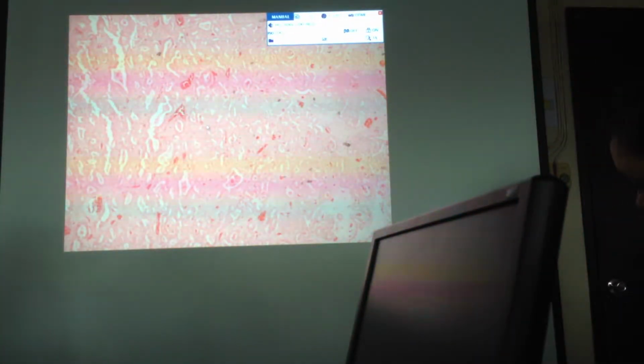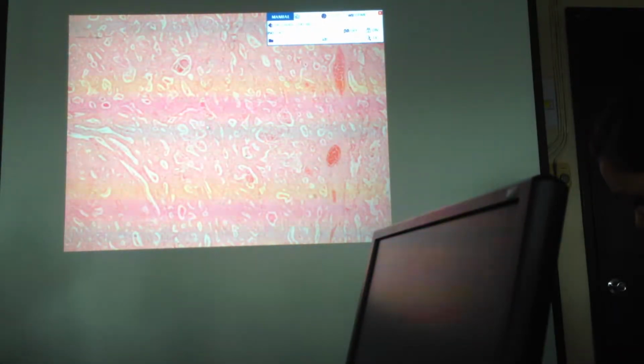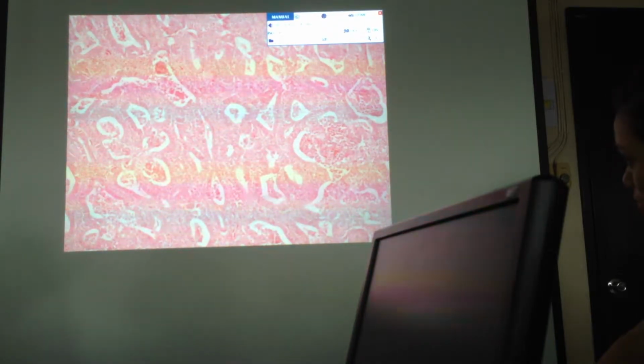Okay. Slide 82, I think there are 2 lesions for slide 82. So this one is what is labeled in your manual, ovarian endometrioid carcinoma. So this is an adenocarcinoma, endometrioid type. Okay, it mimics the lining, or the epithelial cells found in the endometrium.